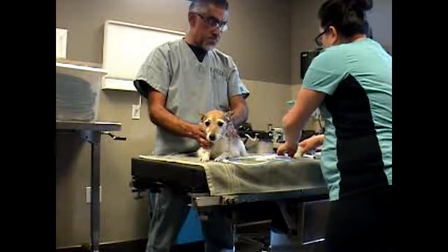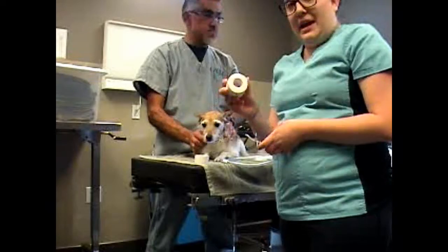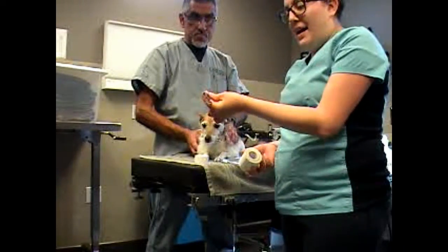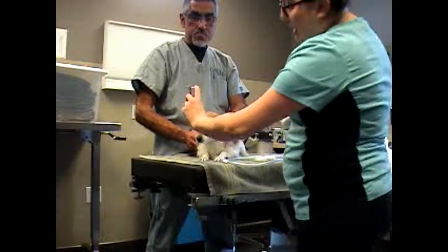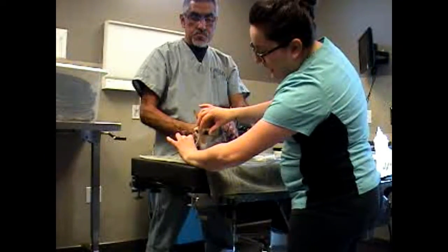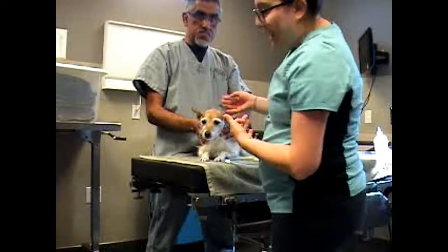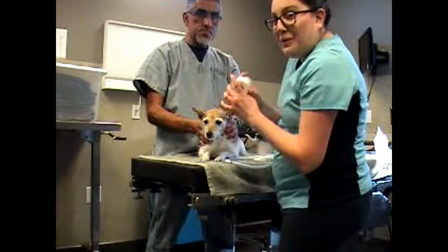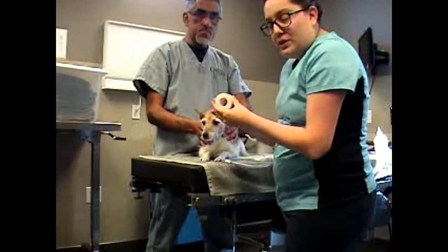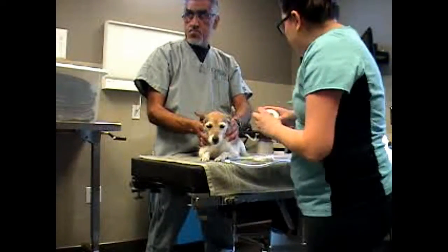With a bigger dog, you could use a 2-inch roll of tape as a little mouth speculum, or we have just a generic normal speculum that we use for our dentals to keep her mouth open. So we would put this on her canine tooth, and it would keep her mouth open and be a good guide for us to get the stomach tube down. In a larger dog, we could fit this in the mouth, and we could actually use the hole in the middle to help guide and feed the stomach tube down her.